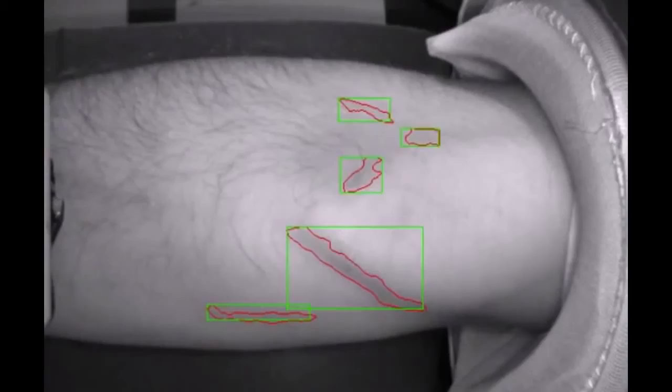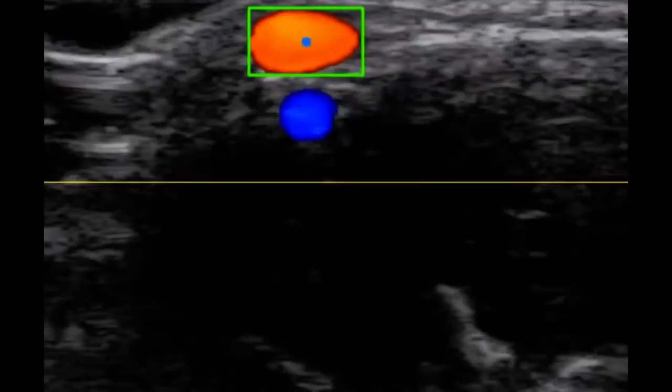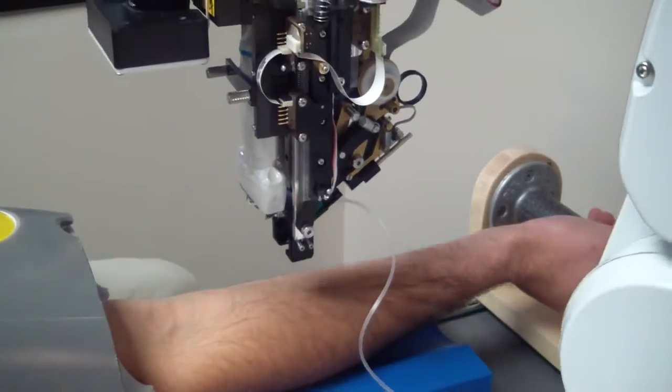It uses infrared light and image analysis to find the right vein, ultrasound to confirm the blood flow in the vein, and robotics to insert a needle into it.